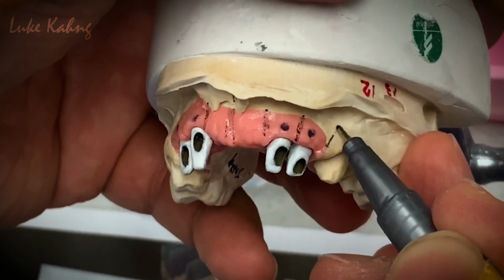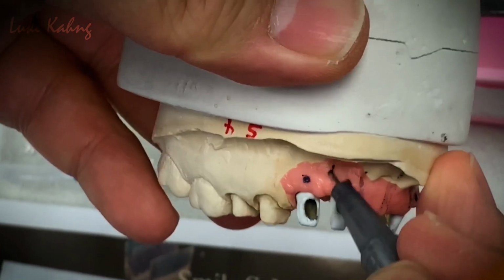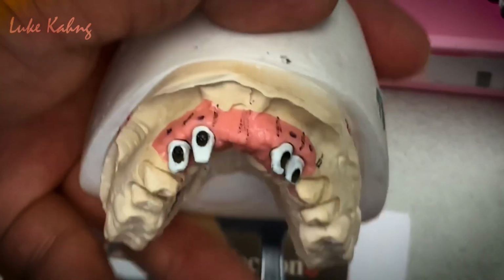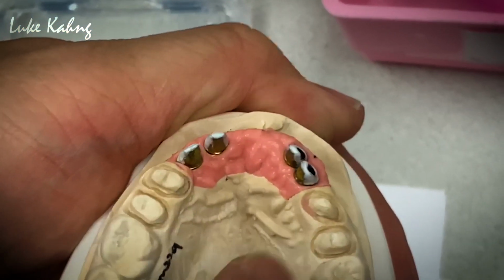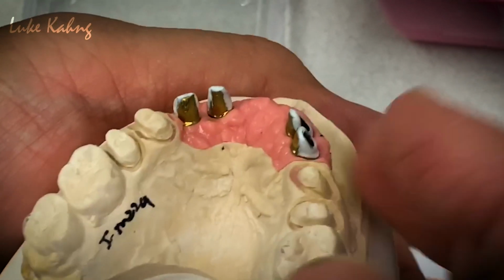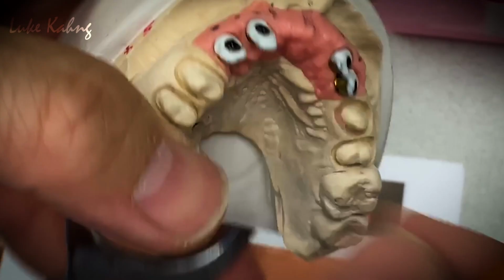Canine, move it, and then premolar, move it. Same thing here. Everything, move it. That's why it's very important to design the alignment. We anodize it, gold anodize it. After that, we put the composite with the gradient, light curing. Okay.